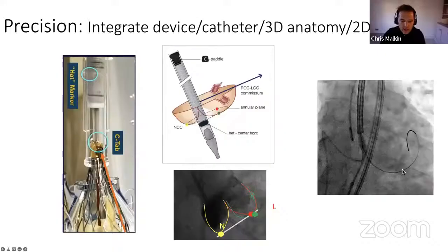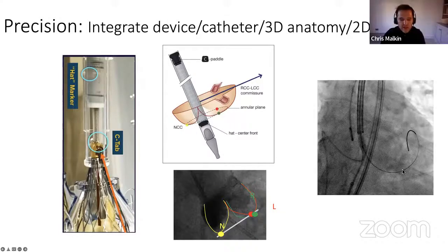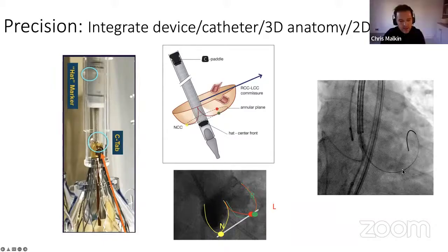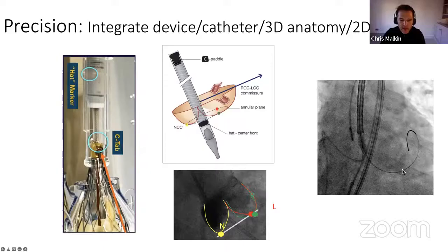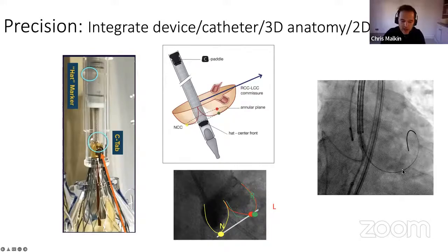It's critical to know how the anatomy of the patient and the fluoroscopic relationships of the TAVI valve fit together. On the left panel that you can see, the commissure of the TAVI valve is directly approximated to the C-tab of the loading capsule, and that's at a 90 degree parallel to what's called the C-paddle. So you can see on the cartoon in the center panel, you have the C-paddle and the hat are at 90 degrees to us. And only by knowing that and knowing where you are fluoroscopically in the patient can you get the commissure of the TAVI valve to implant next to the commissure of the patient's valve.